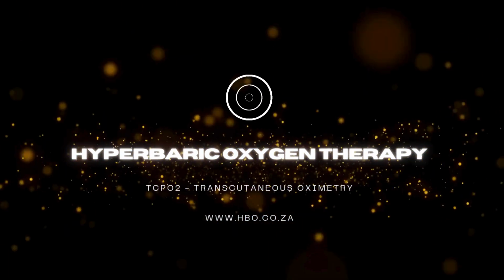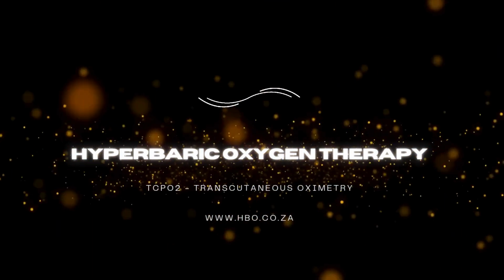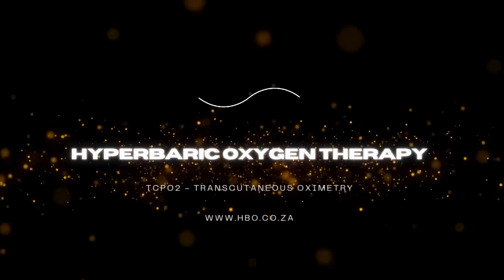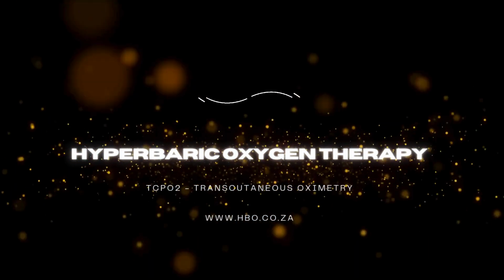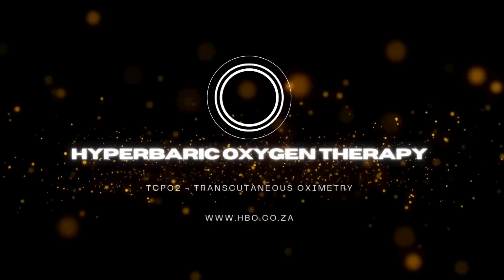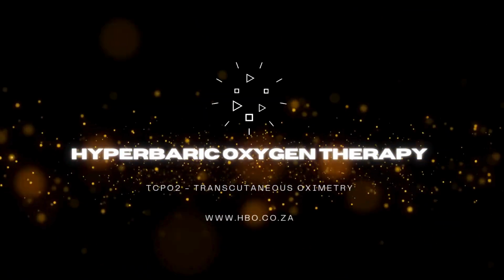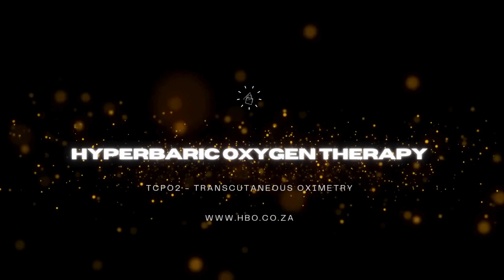Okay. So to wrap this up for the experienced HBOT clinicians listening today, what are the main takeaways on using TcPO2? I think the core message is TcPO2 is a valuable non-invasive tool that can genuinely enhance your HBOT practice. It gives you objective data that helps identify patients with significant tissue hypoxia who are probably the best candidates for HBOT.